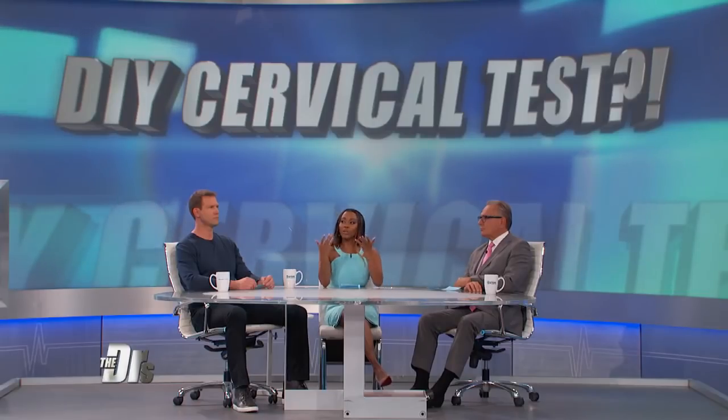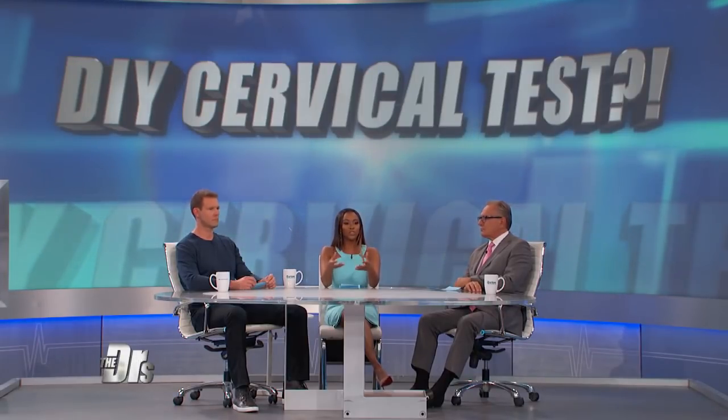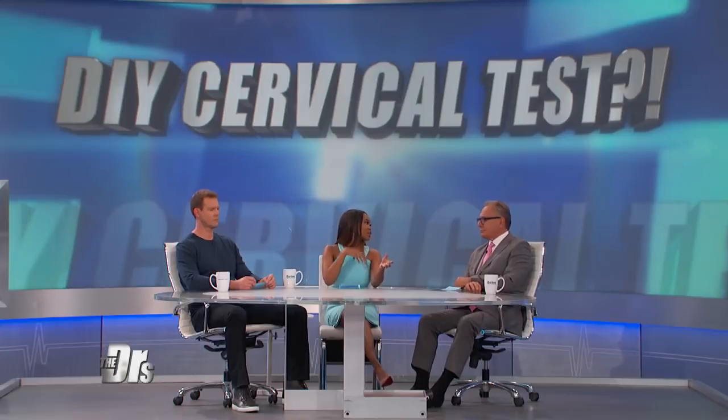This particular kit is taking away the pap smear and they're saying, only tell us if they have HPV. I don't love this because we have a lot of studies saying what we should do if a person has an abnormal pap smear, plus or minus the HPV, but we don't have a lot of studies saying what we should do just with the HPV results. Now, there are some guidelines, but it has not been well studied.